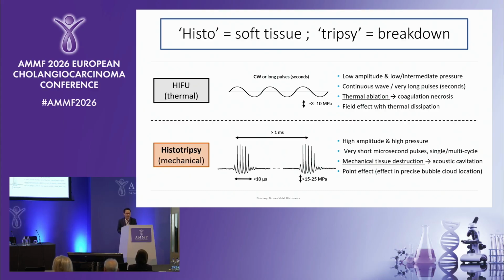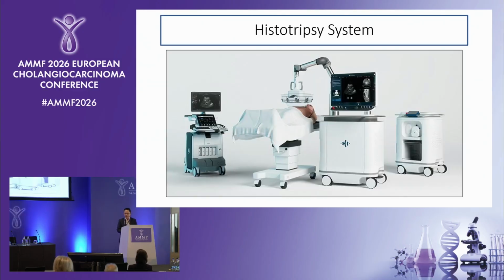It results in mechanical tissue destruction, causing what we call acoustic cavitation, meaning there is a cavity or hole left in situ after the treatment. The effect is very precise, hence the pinpoint effect.